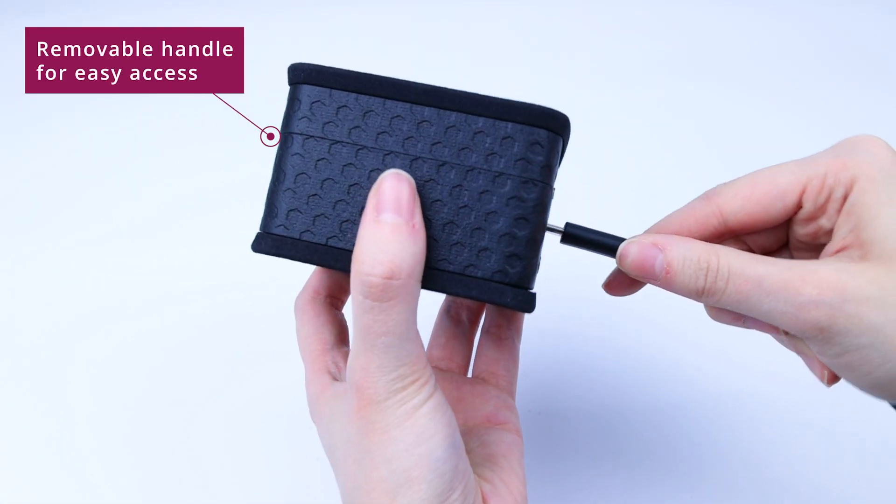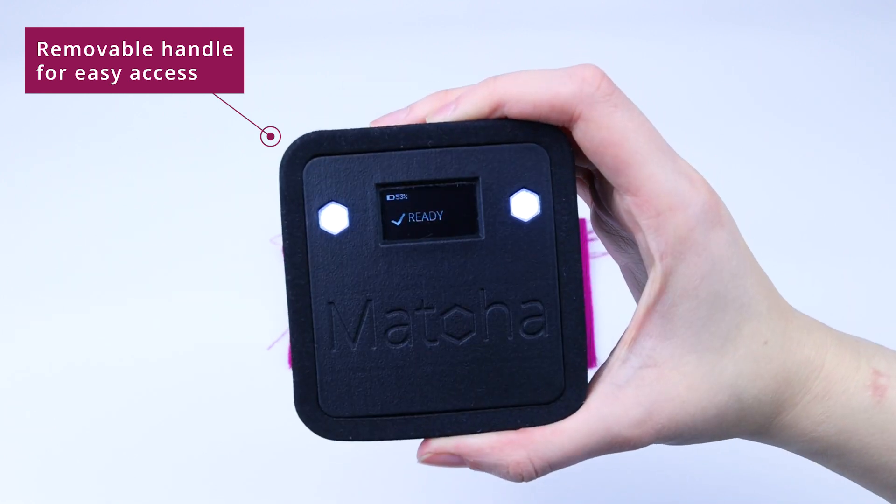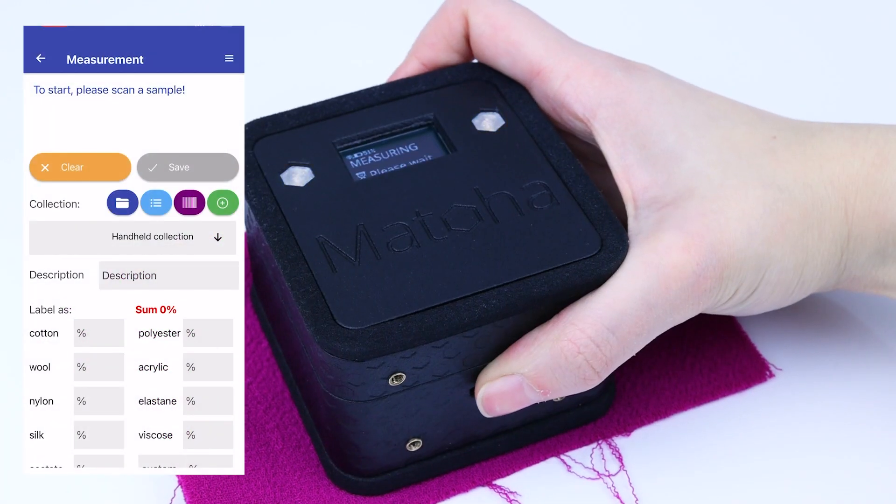The handheld handle is removable to allow easy access. Your results can be easily recorded into our cloud with the included app.